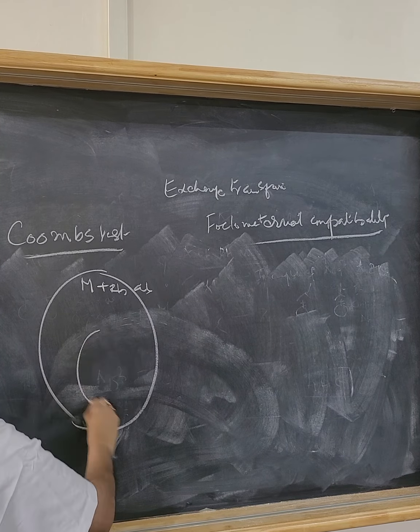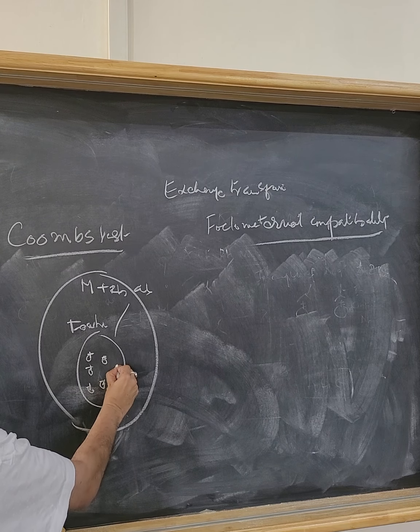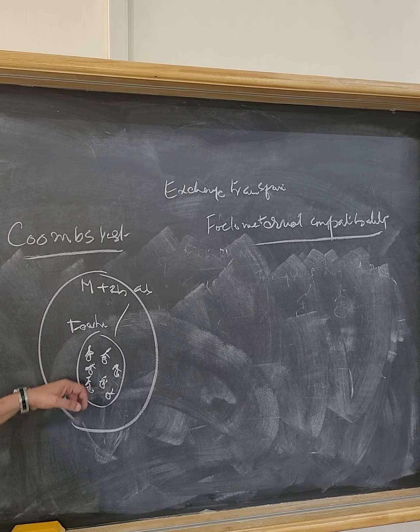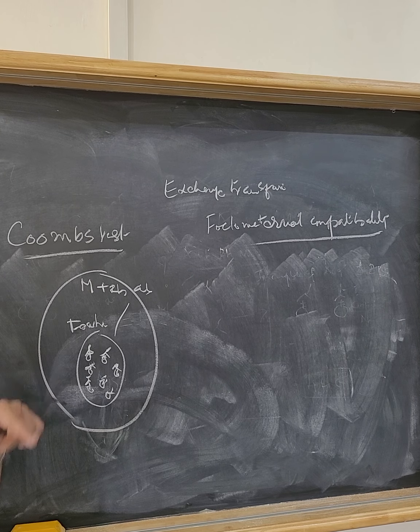Okay. These antibodies have come and attacked this fetal RBCs. They have crossed the placental barrier. The sensitization has taken place. The first step, what we told, is already taken place.